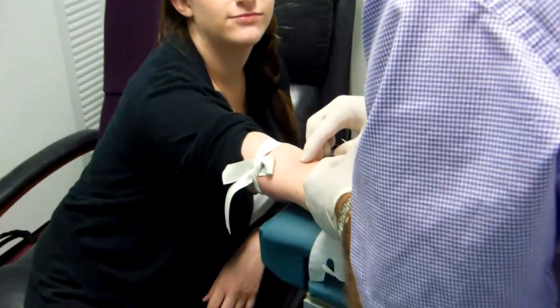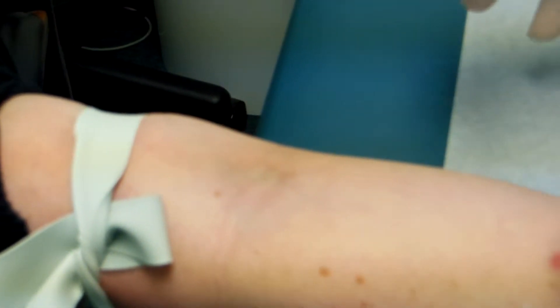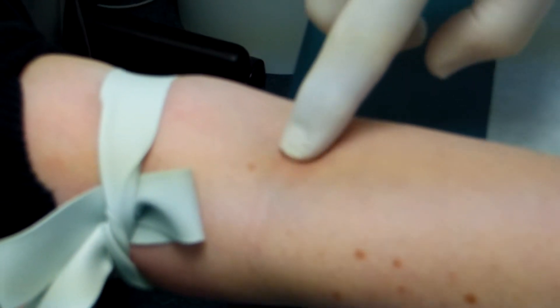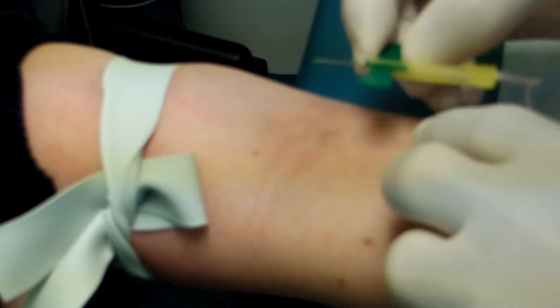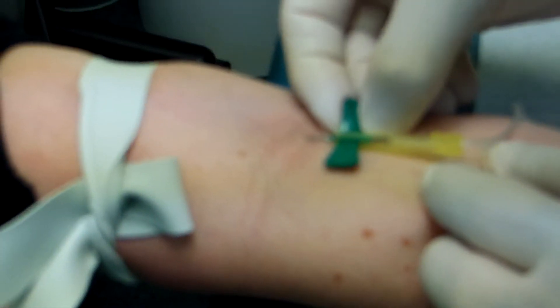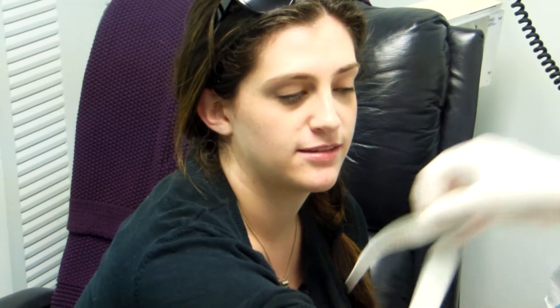So I'm going to show you how easy this is if she's got a vein. Could you open and close your hand a few times? Could you pop one of those veins on top of that? Just release this pressure here.